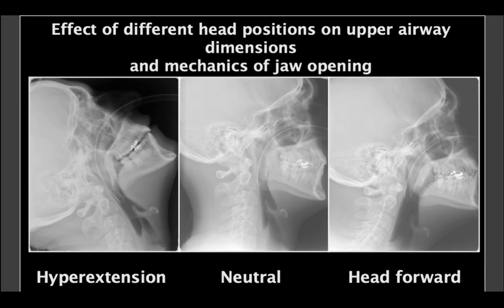So notice the curve here. This person has a nasal tube going in. But you can imagine, when you hyperextend the head, so if you pad behind the shoulders on an adult or put them in an occiput off position without adjusting the head, then your ET tube has to make around a really sharp corner to get to that really anterior airway. Now, a patient who's lying neutral will also have an anterior airway, but definitely better than hyperextended.